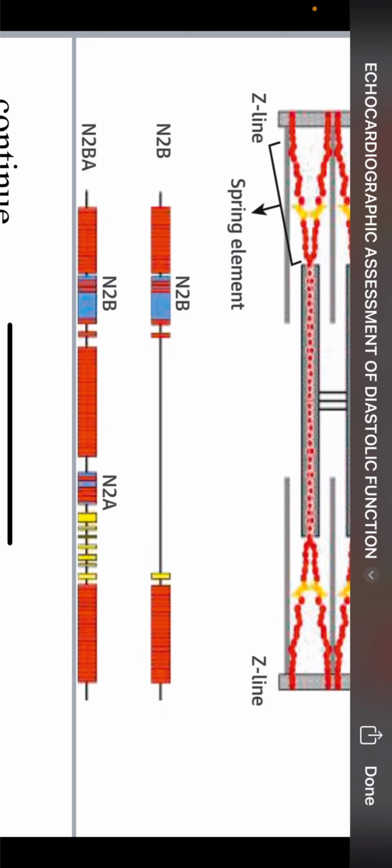So at ventricular level, myocardial relaxation is measured by the rate of left ventricular systolic pressure decay. I've said this already. A normal LV exhibits a faster pressure decline with low minimal pressures. That's why I've said maybe around 0 to 6 millimeters of mercury should be there.